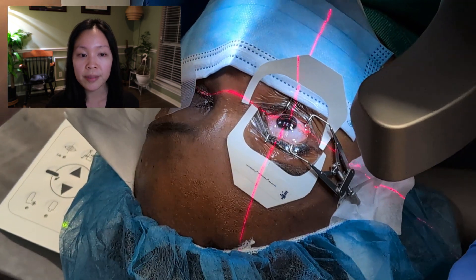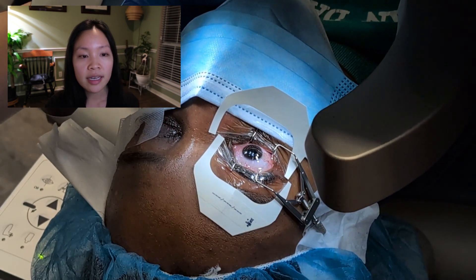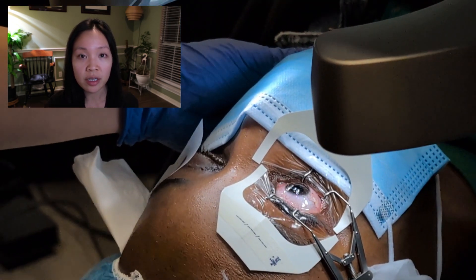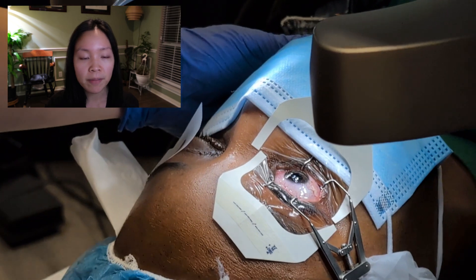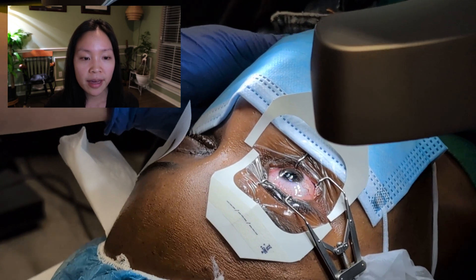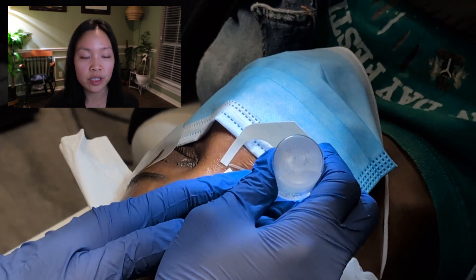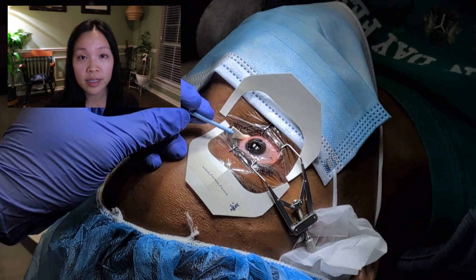Now that all the corneal epithelial cells have been removed from the center treatment zone, we're aligning the eye. I usually place my hand under the patient's chin to help stabilize the head position and I talk to the patient non-stop, instructing her to look straight ahead at a green blinking light that helps center the treatment. As the treatment progresses you'll see the apex of the cornea get a little matte rather than shiny — that is because the laser is physically ablating some of her corneal tissue, which reshapes the cornea and eliminates her need for glasses.